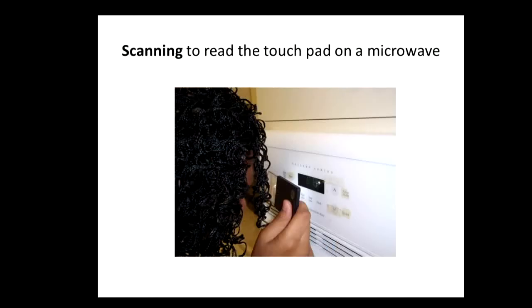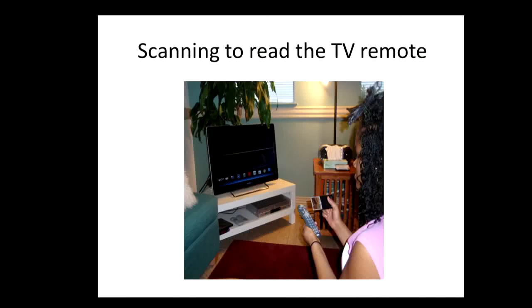The touchpads on a microwave are tiny, and this student scans to read the little message on the small digital display. Some remote controls have enlarged keypads, but the typical household does not have these. It's easy enough to use a magnifier to scan the numbers on remote controls.